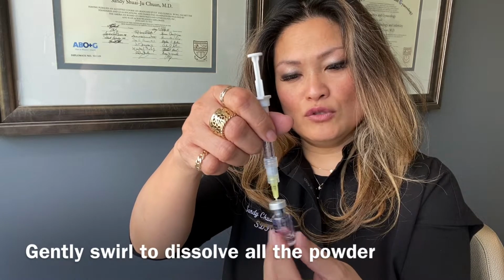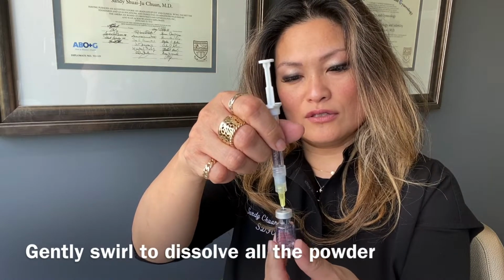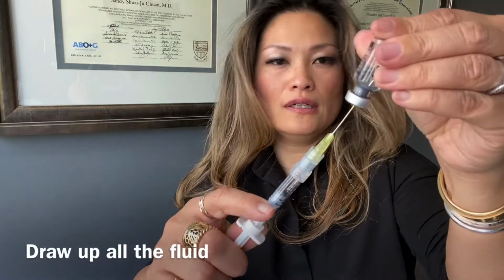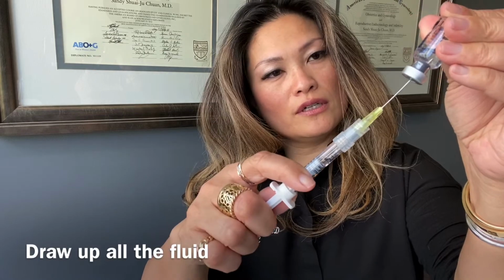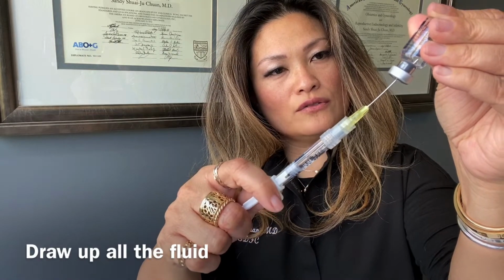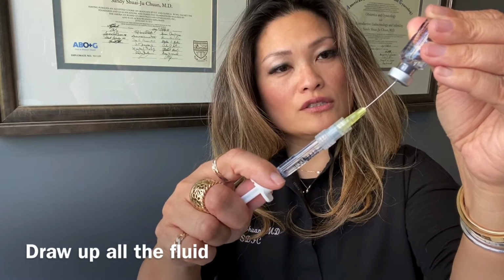Usually I feel like the actual medication that you get is not going to take this long to dissolve. And so it's dissolved, and so just like I taught you before, you're going to go ahead and turn it over and draw that fluid back into the bottle. From the bottle into the syringe, I'm sorry.